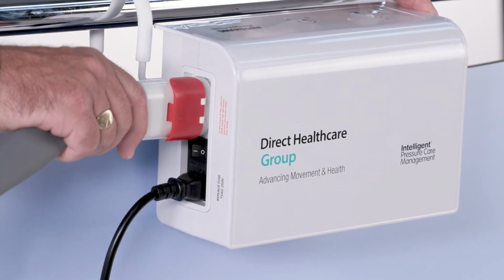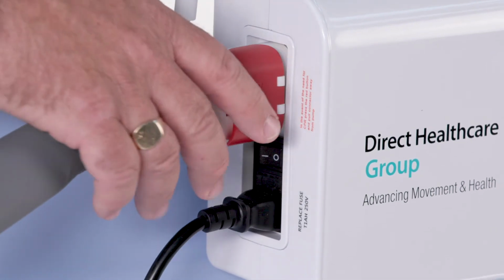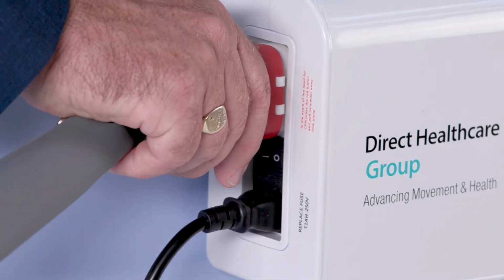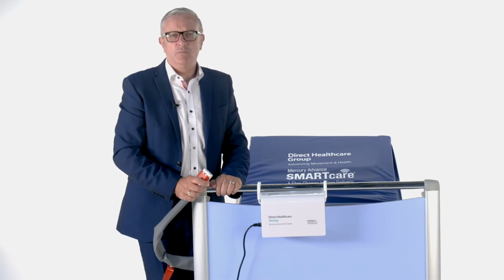When we connect the connector to the pump, we ensure that we press firmly until we hear the click. To disconnect the pump, we reverse the step, pressing the connector tab in and pulling away from the pump. As previously stated, it is important that this step is taken when the mattress is used in its non-powered mode.